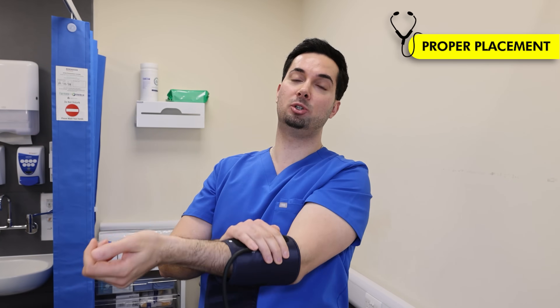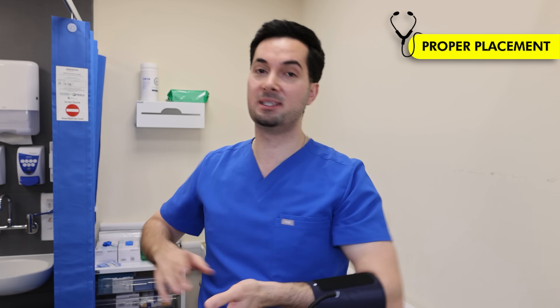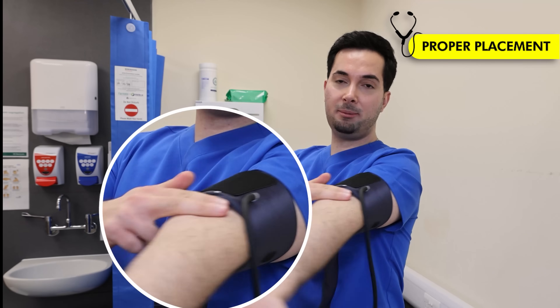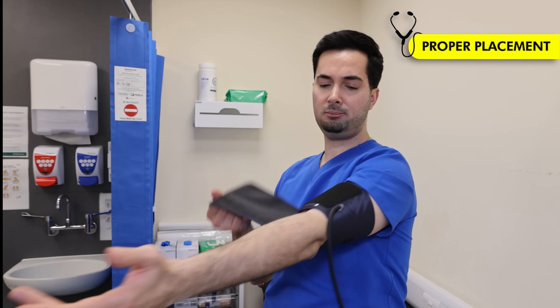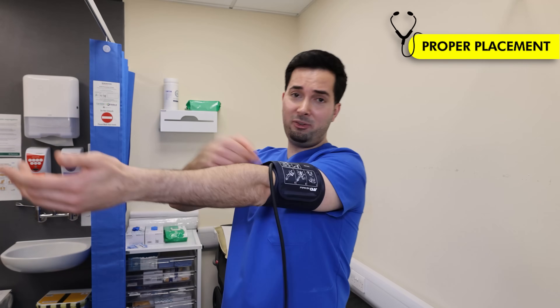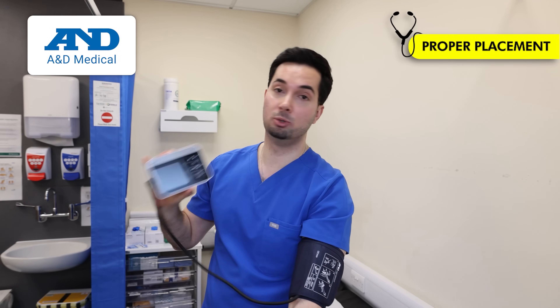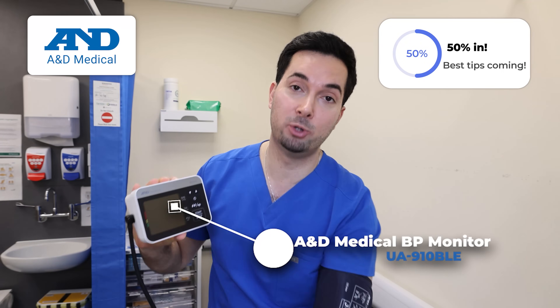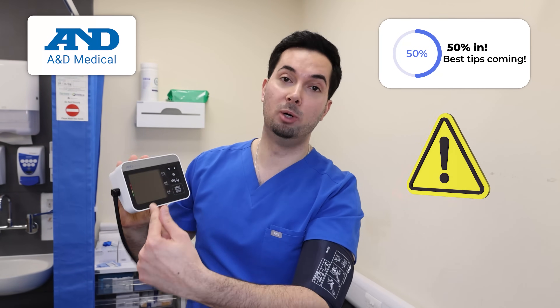Step three: positioning your cuff correctly. If you don't position it correctly, it won't be able to detect vibrations and measure blood pressure accurately. Extend your arm out with your palm facing up. Place the cuff about two fingers' width above your elbow and close it tight enough so that you can fit just about two fingers in snugly. If you can fit more than that, it's not tight enough. Some A&D Medical monitors, like the UA-910BLE, feature advanced cuff-fit detection that will warn you if the cuff is too loose.